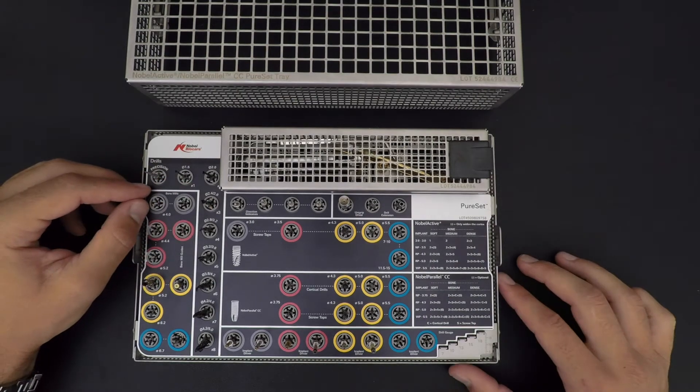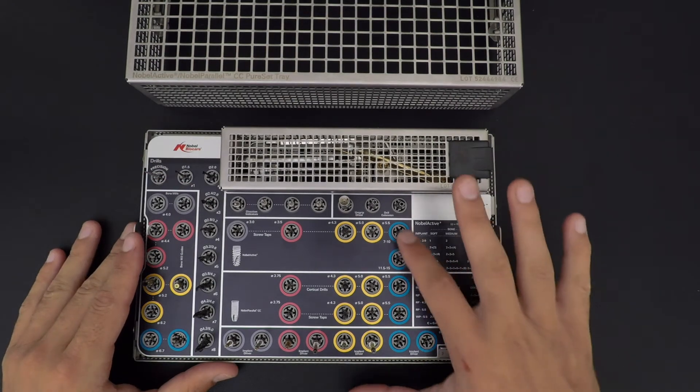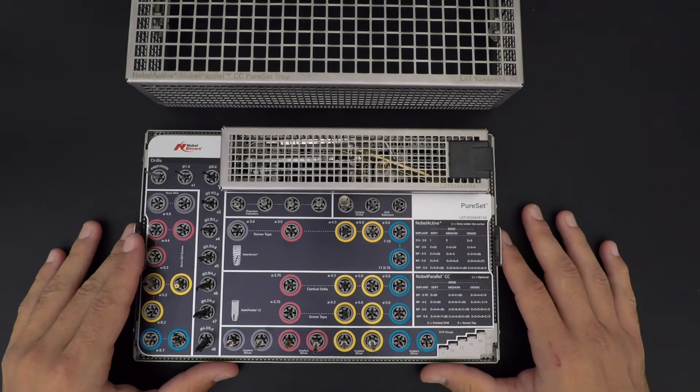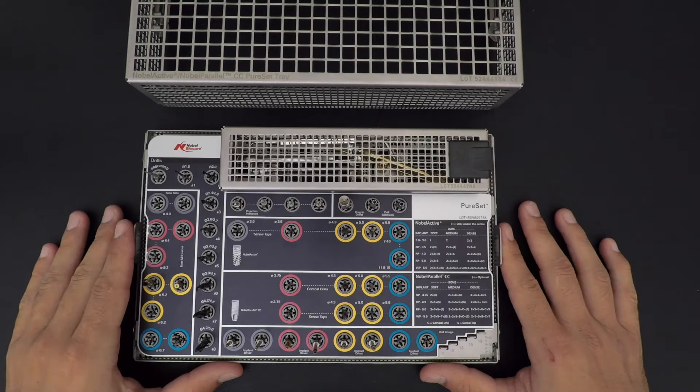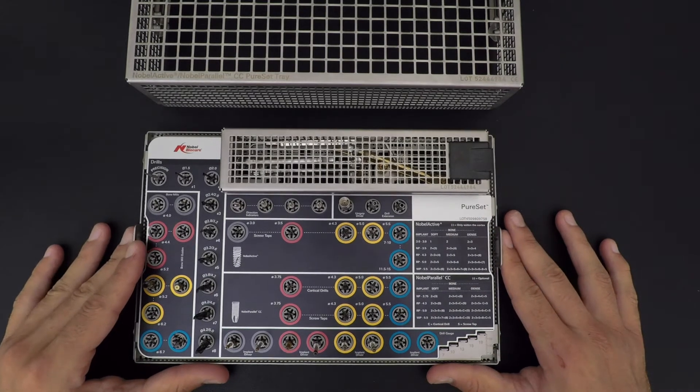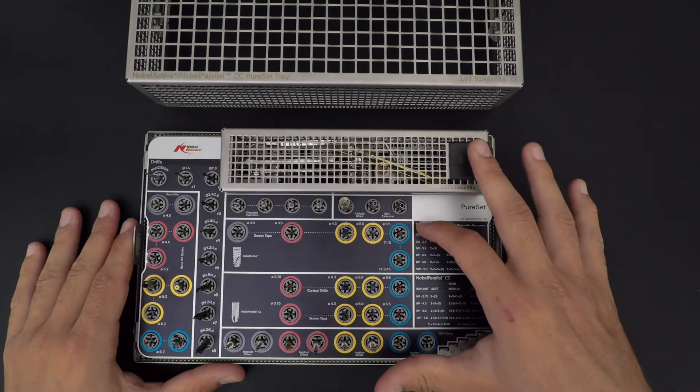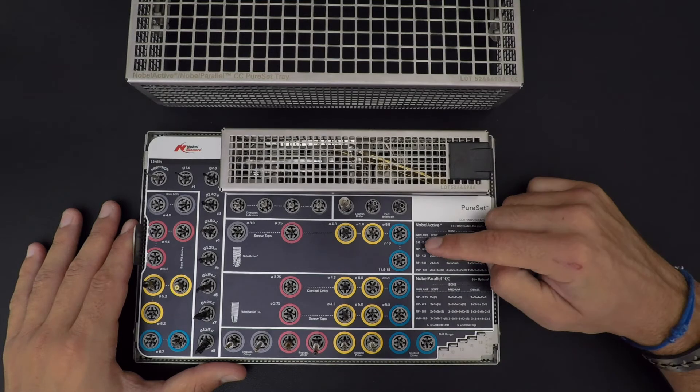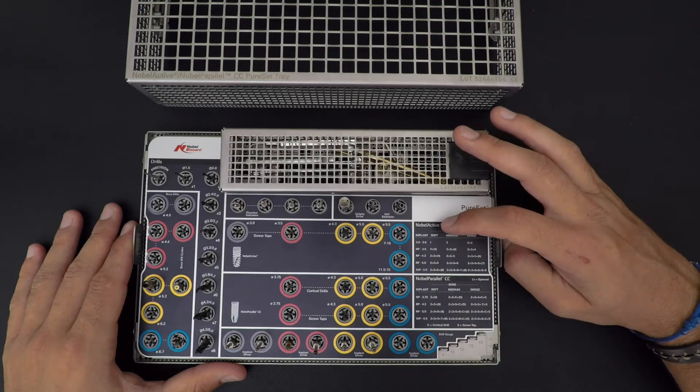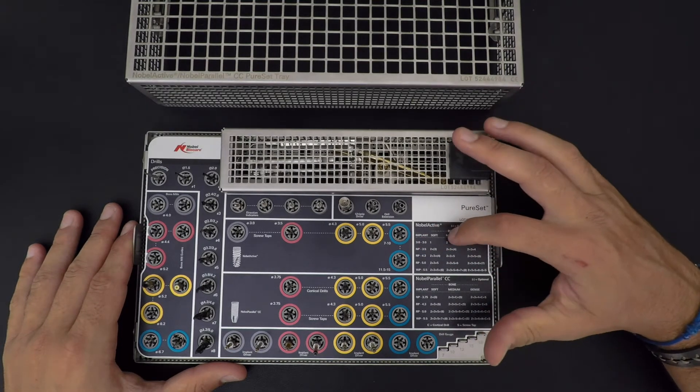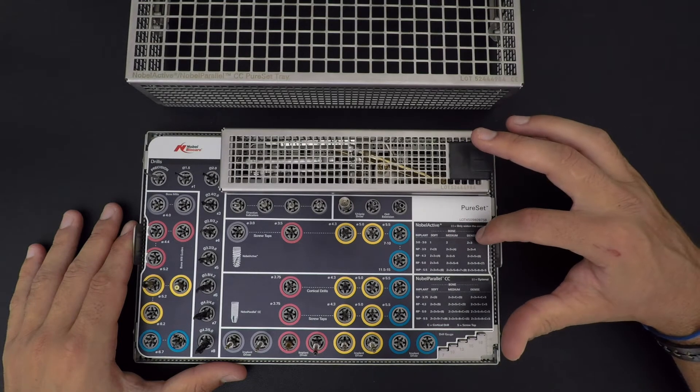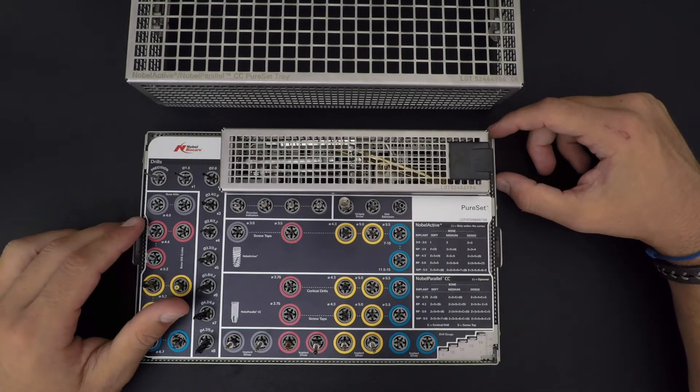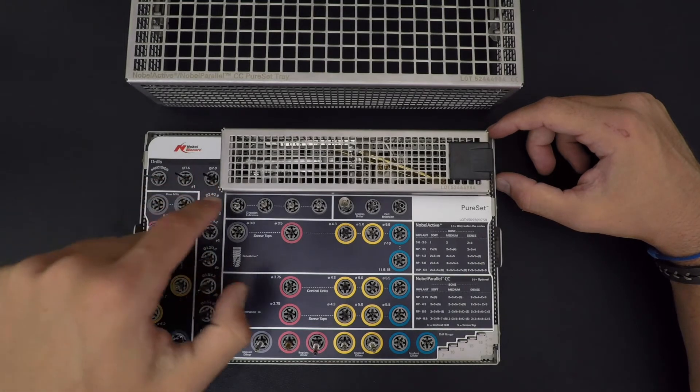Now on the right side of your Pure Set is your drilling protocol. The drilling protocol goes from top to bottom in regard to the implant platform and the bone: soft, medium, and dense. Basically, you remember I mentioned the numbers on the side in addition to the diameter - this is what it means.